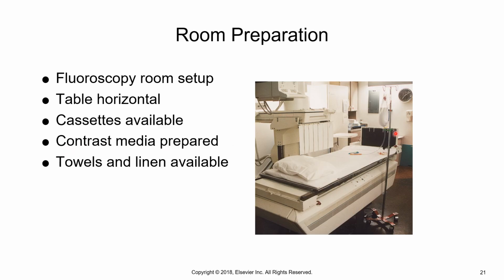You'd want to have your contrast media. You probably aren't going to prepare that until after the scout image is cleared, because if you prepare it and then the radiologist decides they're not going to do the exam, there's nothing you can do with this bag once it's made, unless you had a patient right behind that patient that was getting prepped for the same thing. That would be waste.